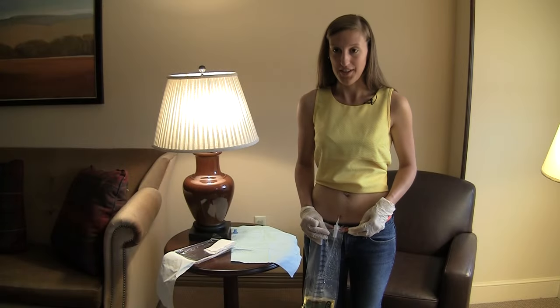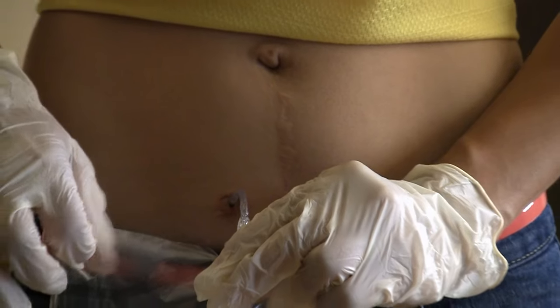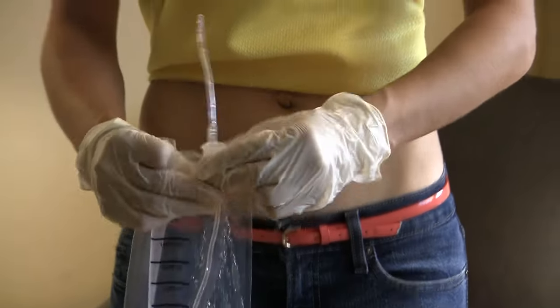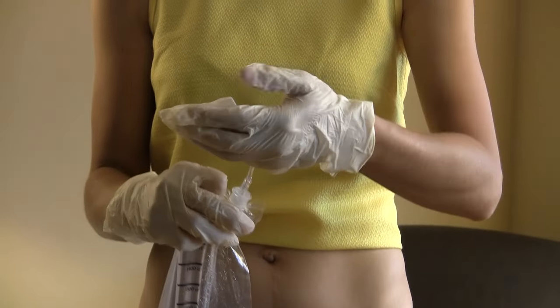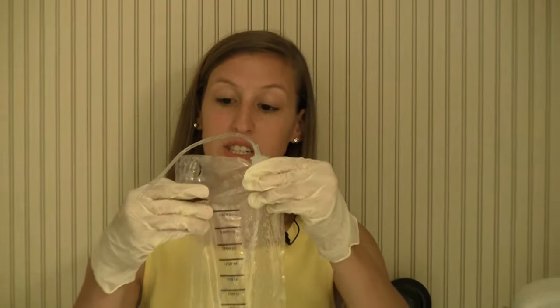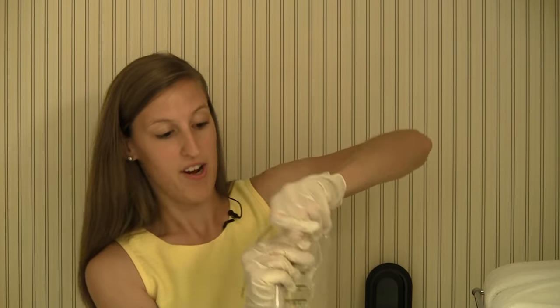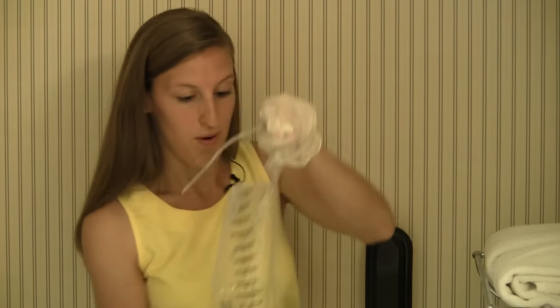After the drainage is complete, I'm going to take the catheter and the bag out by using the finger hole and also a piece of gauze by placing it on the tip of the catheter. After catheterizing, I need to drain the urine into the toilet. However, if you need a sterile sample, you can go to the MTG website and they'll have information for you there. Right now I'm just going to tear where it says tear all the way across and pour.